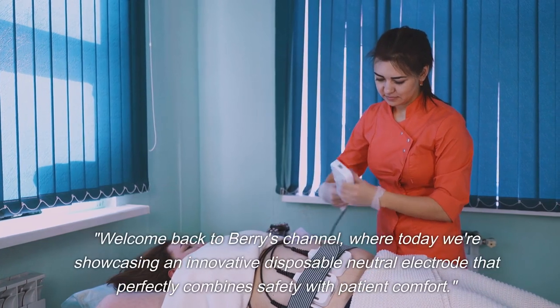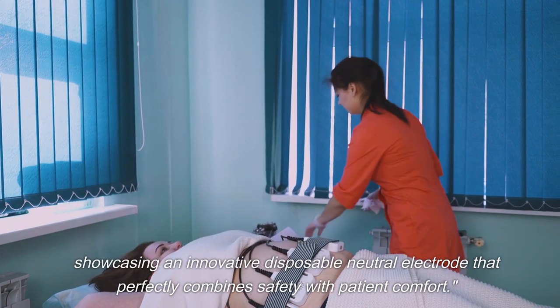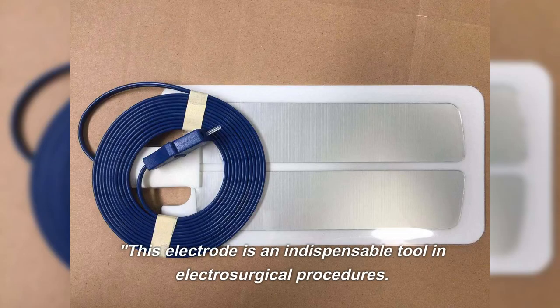Welcome back to Berry's channel where today we're showcasing an innovative disposable neutral electrode that perfectly combines safety with patient comfort. This electrode is an indispensable tool in electrosurgical procedures.